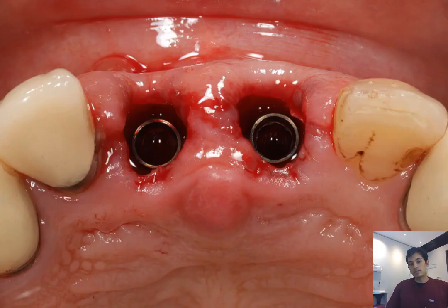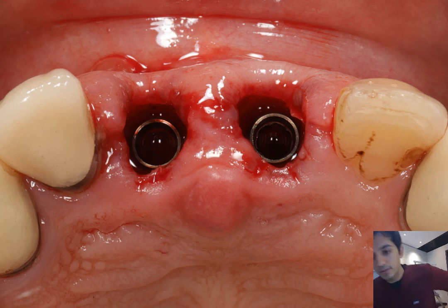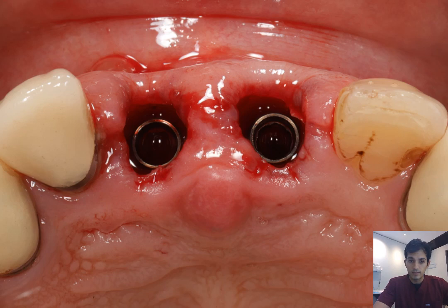We placed our implants again through the guide, a fully guided approach, using the implant carrier found in our R2 Gate kit. The technique I use when I'm doing immediate implants is the dual zone approach proposed by Dennis Tarnow and his team several years ago.